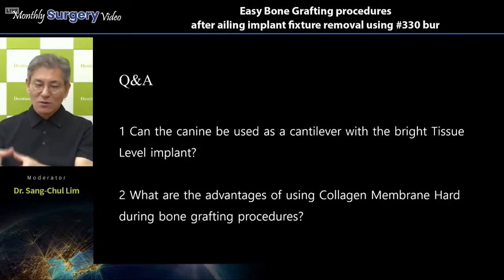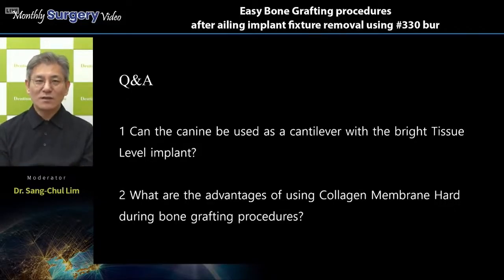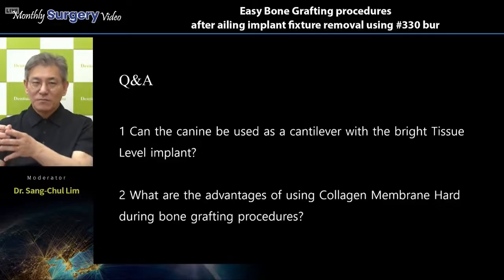Let's think about this osteotomy. Maybe during just only 2 drills, even though it is two drillings, maybe this distal bone plate would be squeezed distally, because this area is void, right? So Dr. Chung doesn't want any more bone loosening in this area. He wants to get a higher initial stability. This area is very important, right?